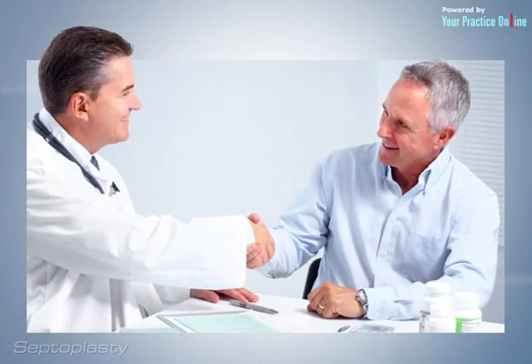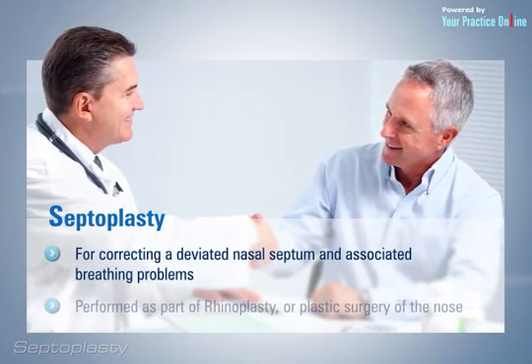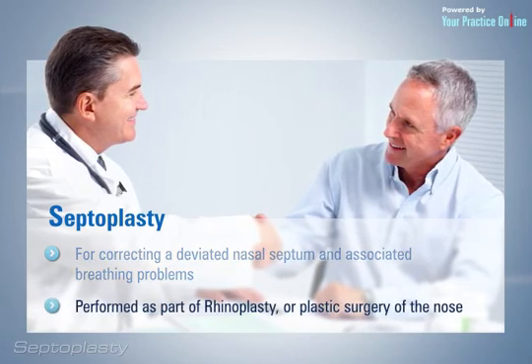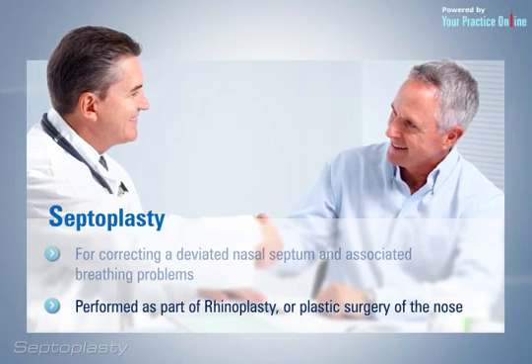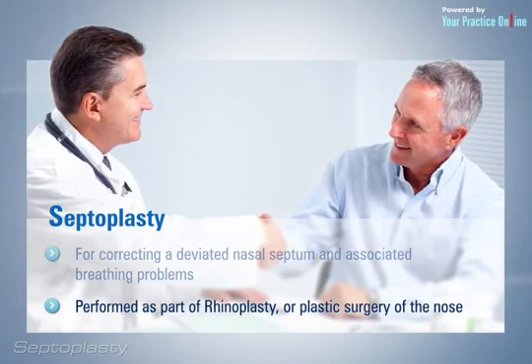Septoplasty is a surgical procedure for correcting a deviated nasal septum and associated breathing problems. Septoplasty is also commonly performed as part of rhinoplasty, or plastic surgery of the nose.